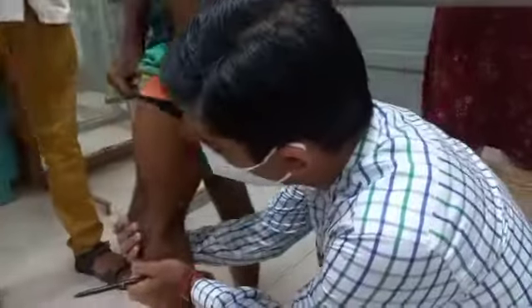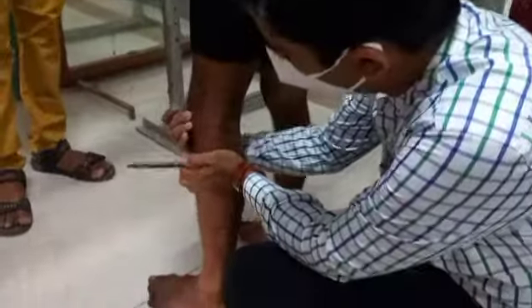Okay. Now another measurement I will be taking. I will find out the patella. Where is the patella? Knowing that his patella is not dislocated, I will put one line on the lateral aspect, at the mid patella. I will try to find the mid patella line, not the mid patella tendon line. I am just getting one line drawn.